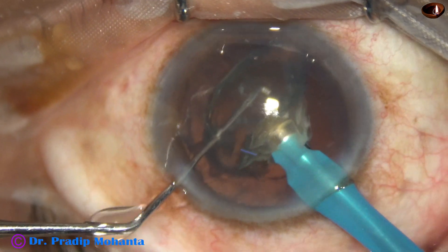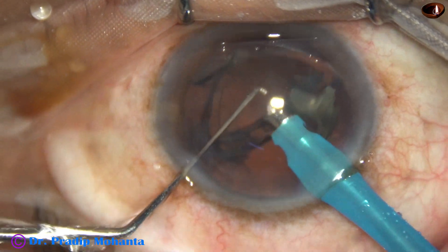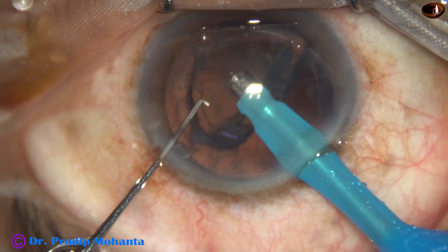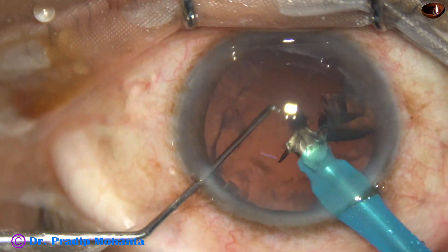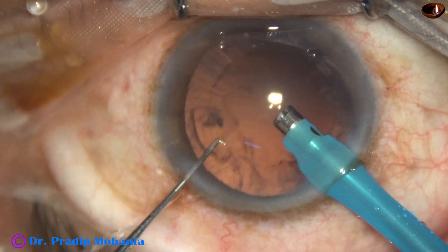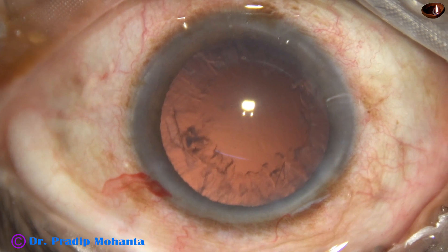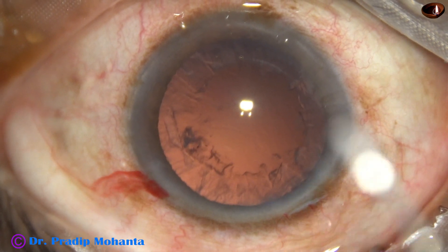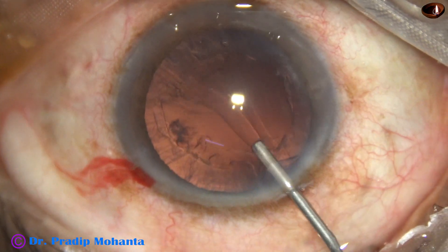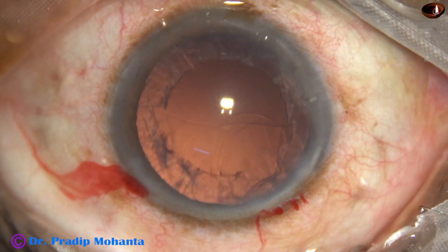Now this is the last piece. The epinucleus has been removed from the piece and it is used to protect the posterior capsule. The nucleus is managed. Now the chamber is filled up, underfilled with viscoelastic.